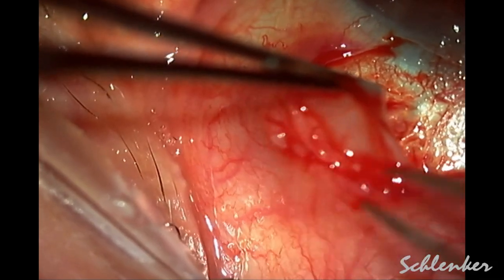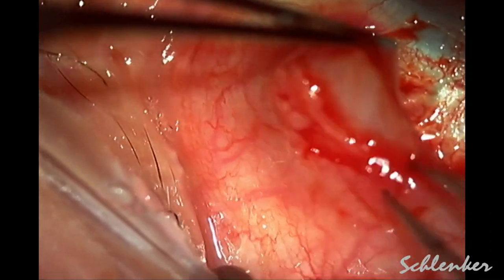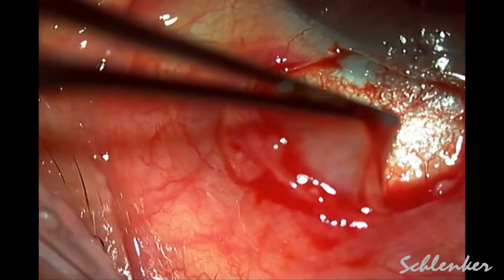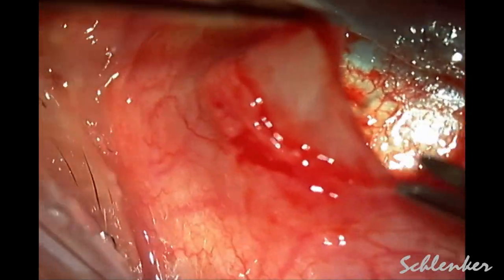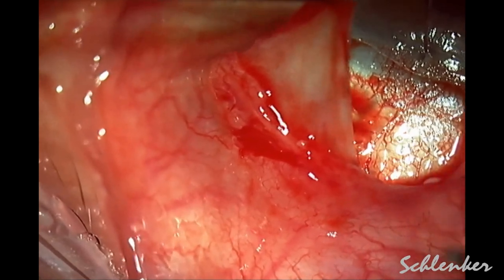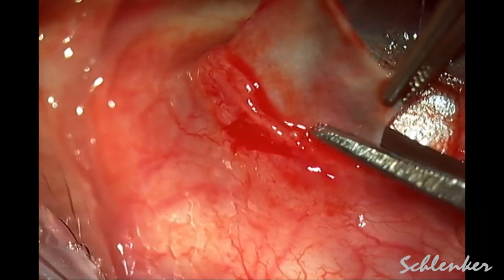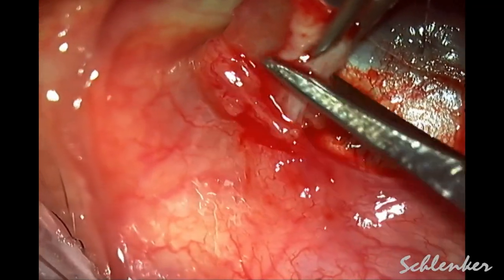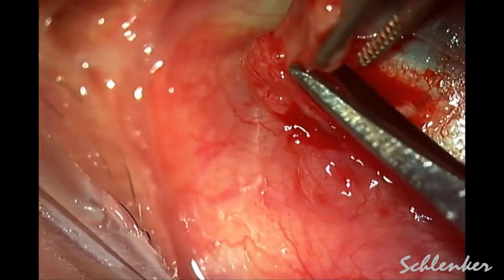We had a decision to make regarding Tenon's. Often when I'm doing closures for a PreserFlo micro shunt I will keep Tenon's and use it as a protective feature during closure, but with the Xen I don't think this is as important — and we already saw the aggressive nature of the scar tissue.